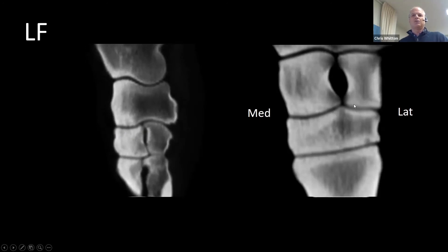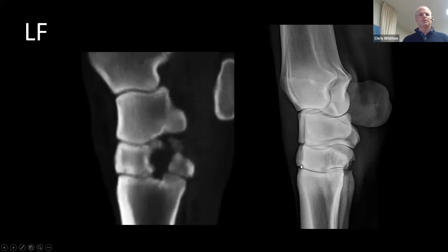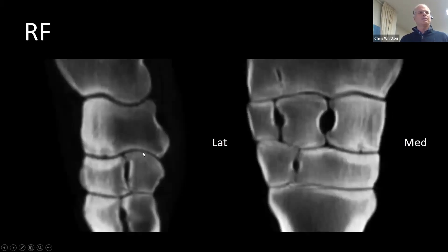If you'd done arthroscopy you would have been looking for that lesion up here, but it's actually sitting down here — so we know that from the CT. On x-ray I struggled to actually identify it because of the complexity of the joint, and that's the beauty of CT in these complex joints that are hard to assess radiographically. Interestingly, in its contralateral limb it's also got a subchondral cystic lesion in the radiocarpal bone which we couldn't see on x-ray.